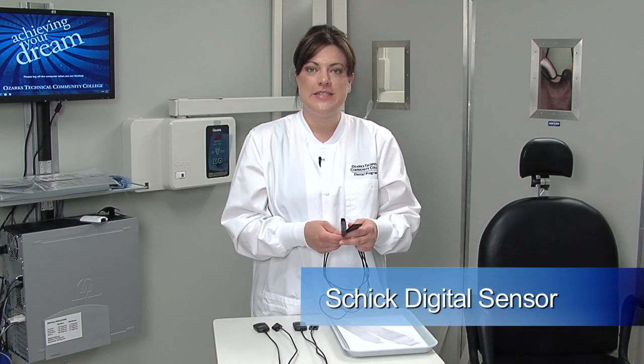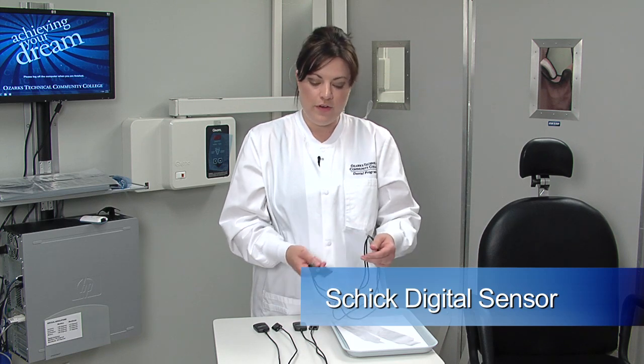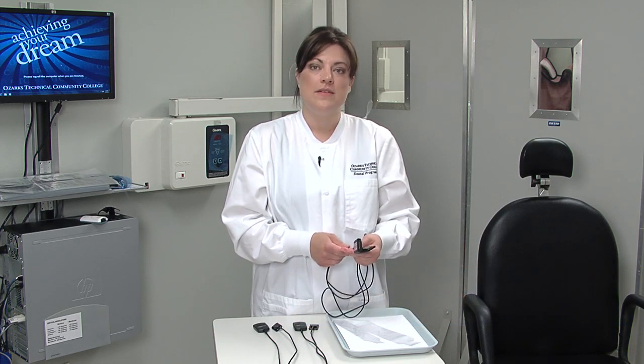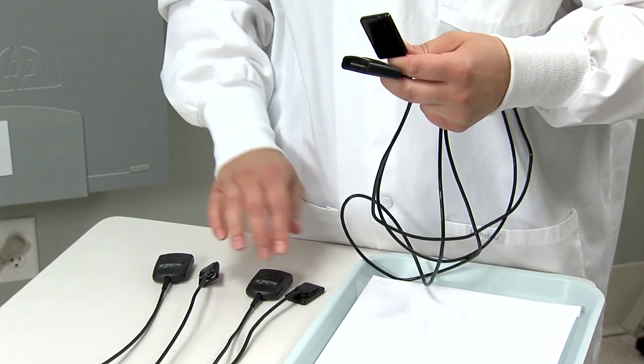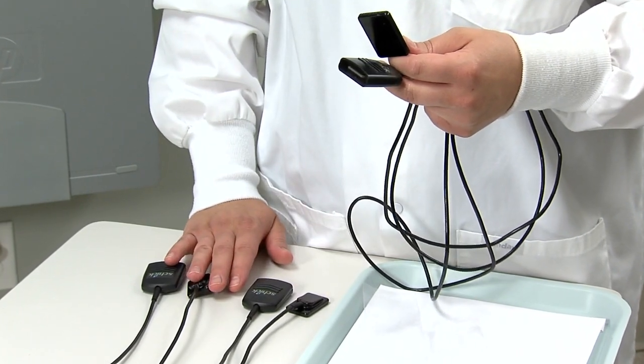The digital imaging system that's utilized in the OTC dental clinic and labs is the Schick CDR digital sensor. In front of me, I have the 3 different sizes of sensors. Sensors come in sizes just like traditional intraoral film. In front of me, I have the size 2 sensor, and then on the table, here's your size 1 and a size 0 pedodontic sensor.